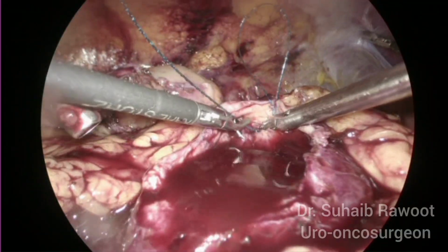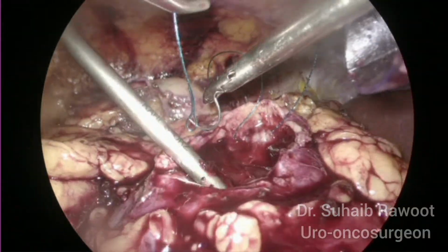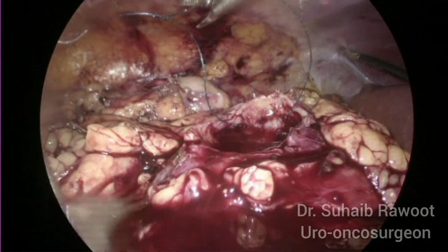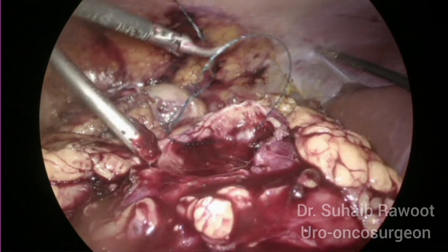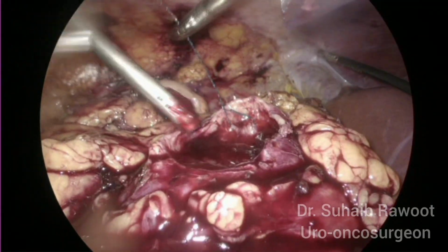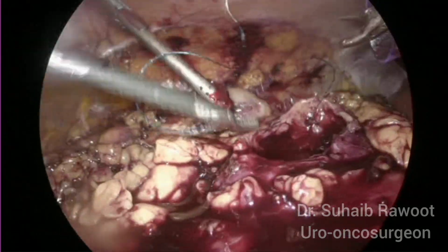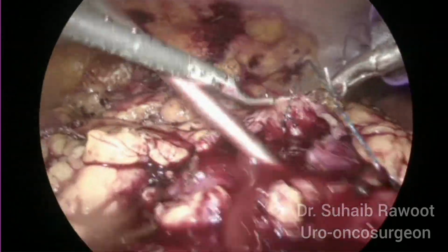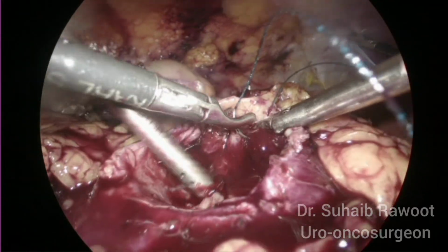Now we are starting the renorrhaphy. I usually close the defect in two layers, first the inner one and then the outer one. One important point here is to keep the sutures that you need for renorrhaphy ready beforehand before you clamp the renal arteries so that you minimize the warm ischemia time. Inner renorrhaphy is done with V-Loc 3-0 suture and outer is done with V-Loc 2-0 suture.